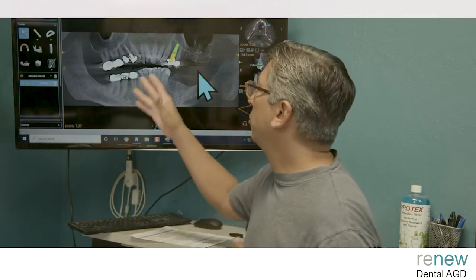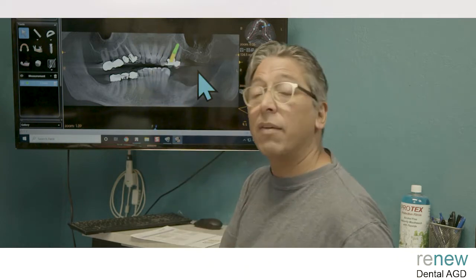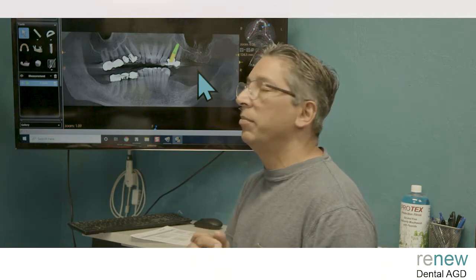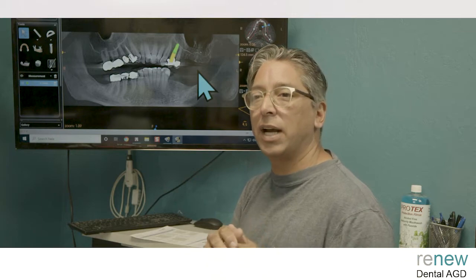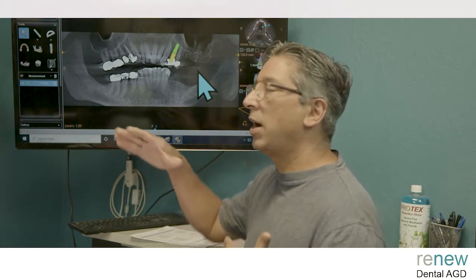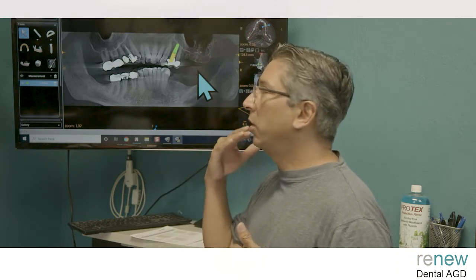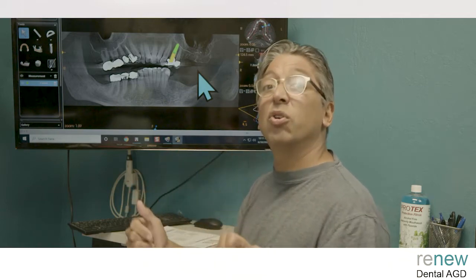But outside of that, you could also be more conservative. You can take those teeth out. You can graft them, let those heal appropriately. You can do a sinus augmentation crestally and not place the implant in if you didn't want to. Make sure that the graft stays there, and then just do pretty straightforward implant dentistry after that. So you can simplify the kind of groundwork with the bone earlier on before getting into doing a surgery where you're trying to do it all at once.